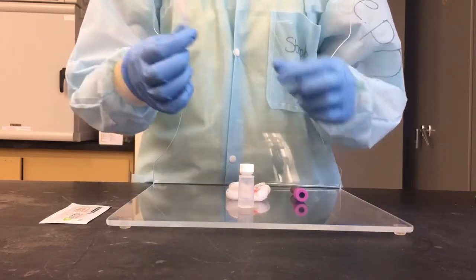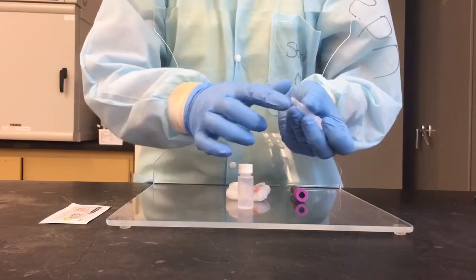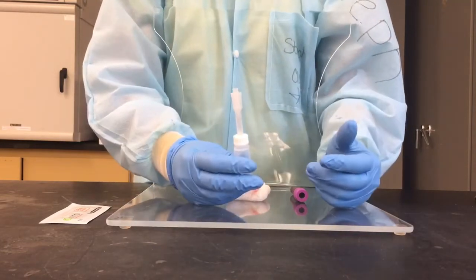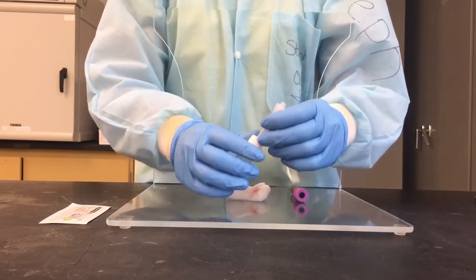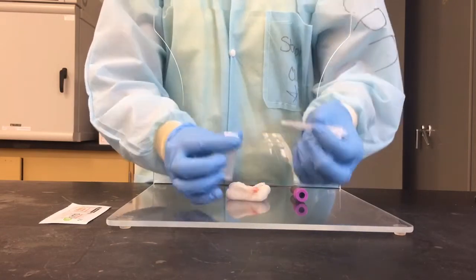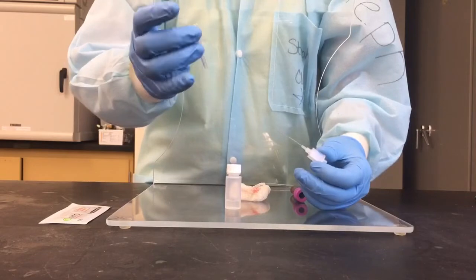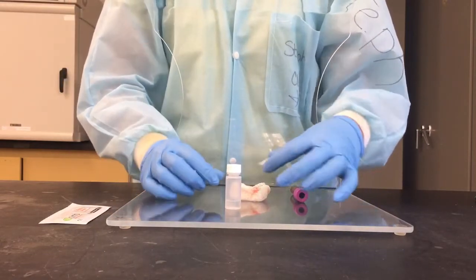The first thing that you want to do is leave your pipette assembly fully intact, but take the hard pointy end here and shove a hole through the top of that reservoir cap. You want to push evenly and consistently downward. You don't need a ton of pressure, but you need just a little bit, so you do have to put a little bit of force behind it. Once you have a hole, pull this out, pull down on that hard plastic part, and then put the hard plastic part into the sharps container.